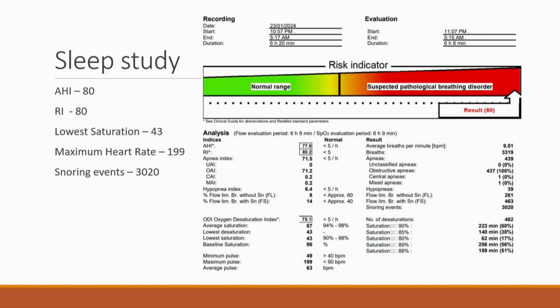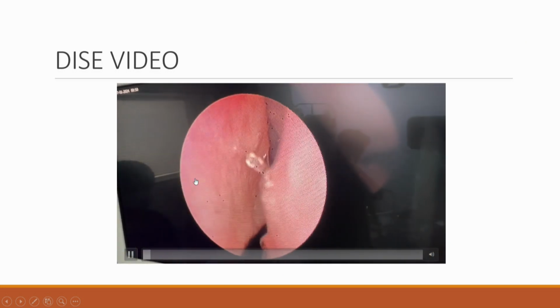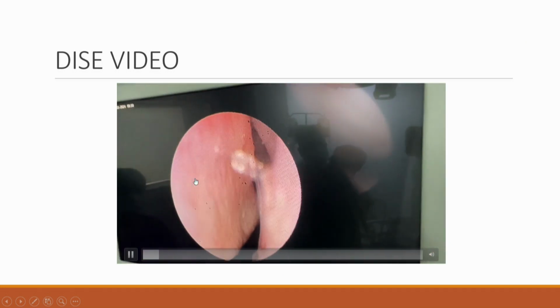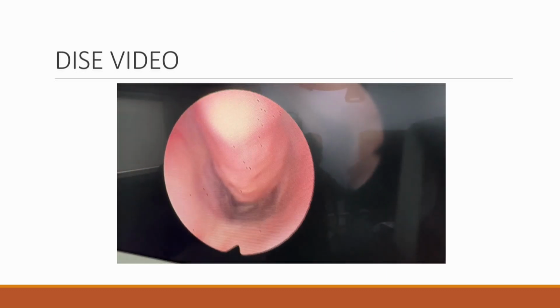This is the sleep study scores. AHI is 80 and low SAT is 43, and this patient had very severe obstructive sleep apnea, and when we did the DISE there was a severe nasal septal deviation, adenoid tissue, all those things I will show you in the DISE there. I think you are seeing the live DISE.